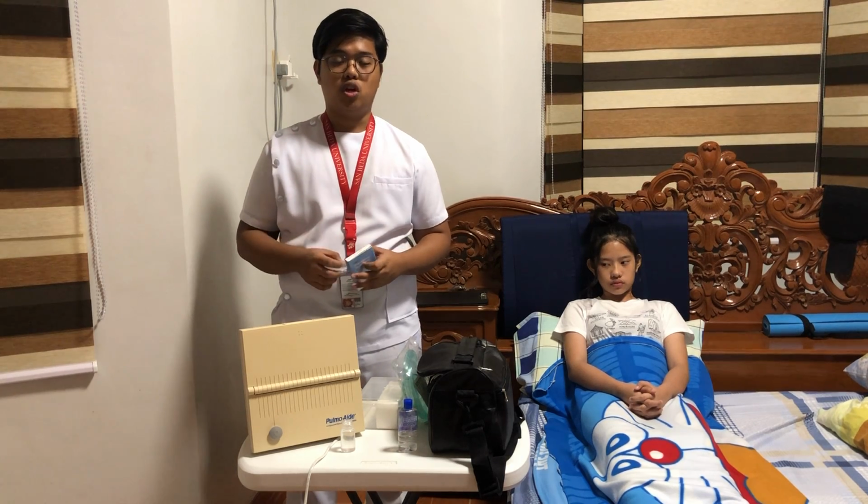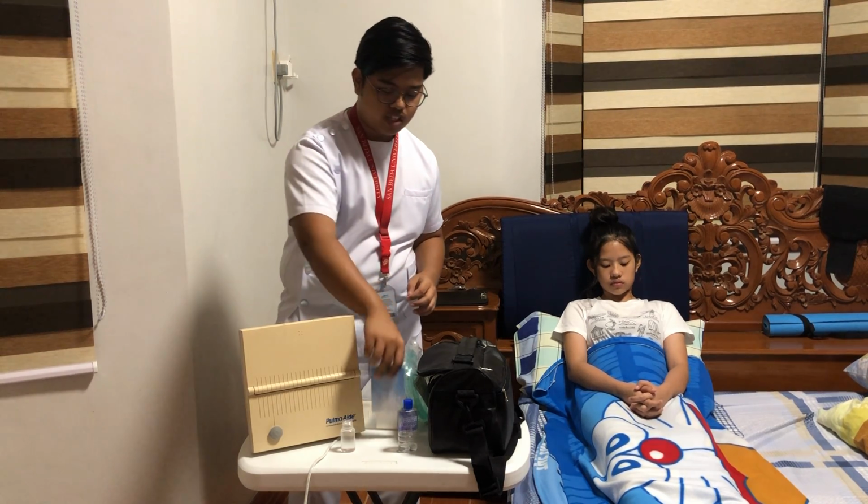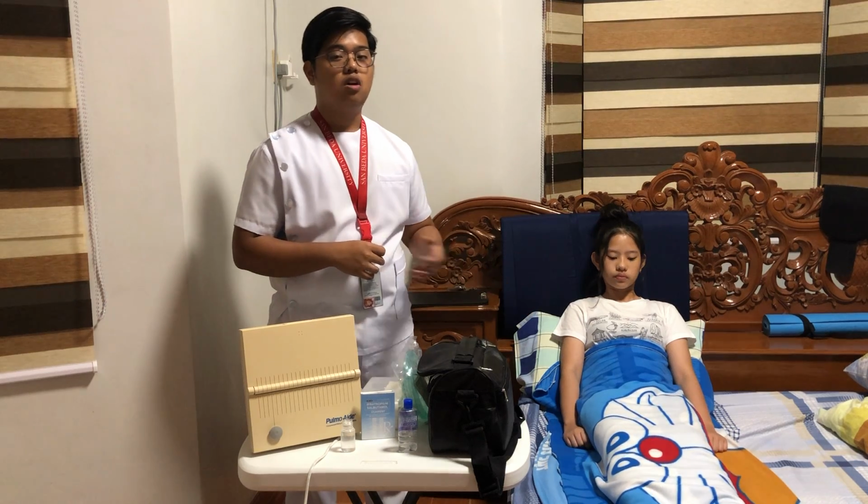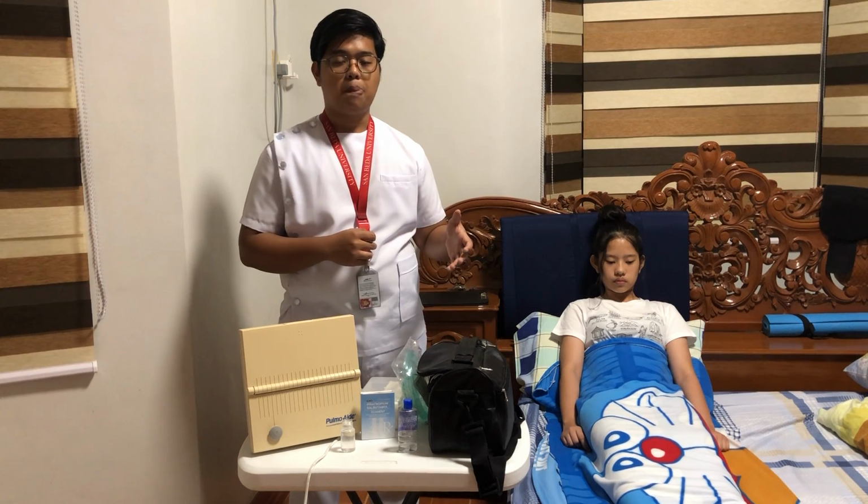Afterwards, the next thing that we need to do is to label all our medication and medication containers, and of course other solutions. And we must keep in mind that in handling such things, we must use the sterile technique to prevent cross-contamination. And then afterwards, we need to settle or discuss any unresolved concerns related to medications together with the patient's doctor or attending physician, so that we may discuss what are the appropriate plans of action that we must conduct.